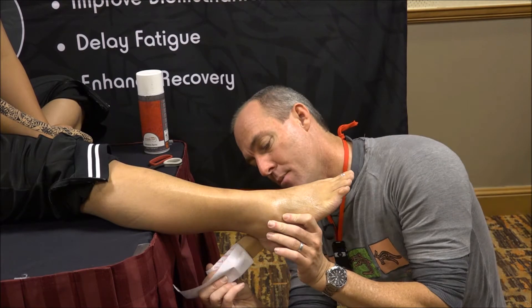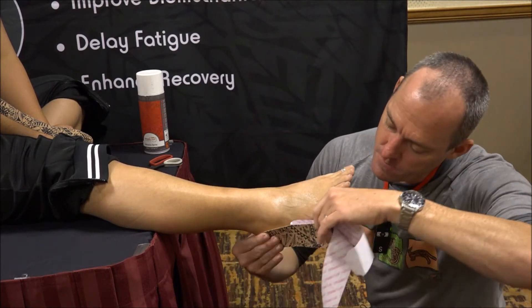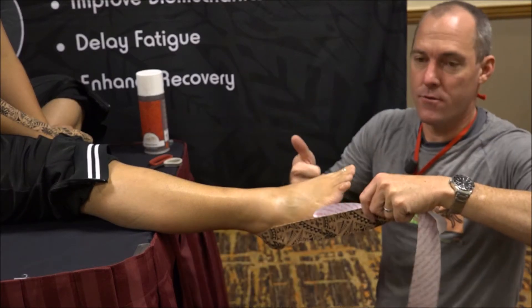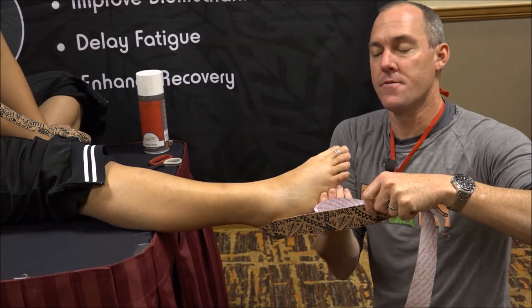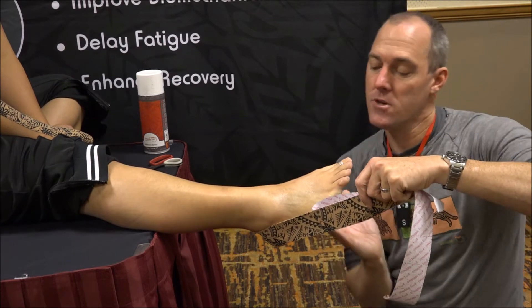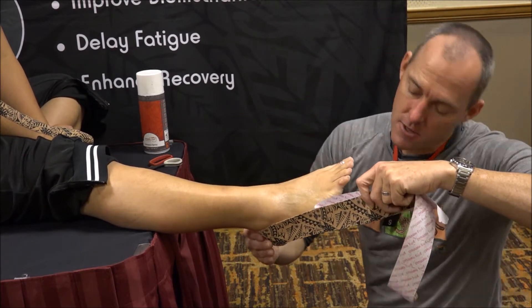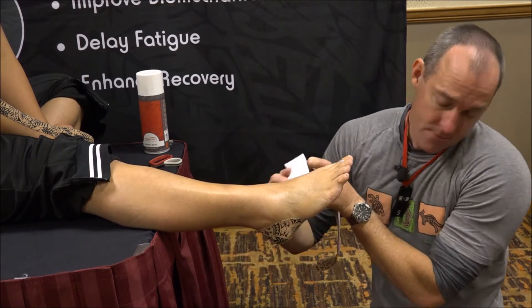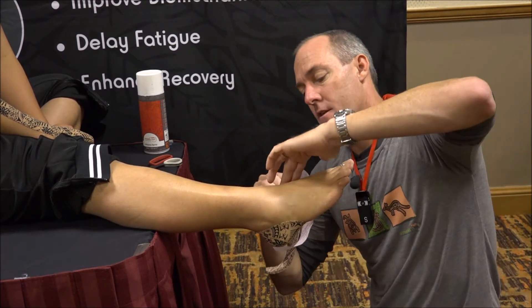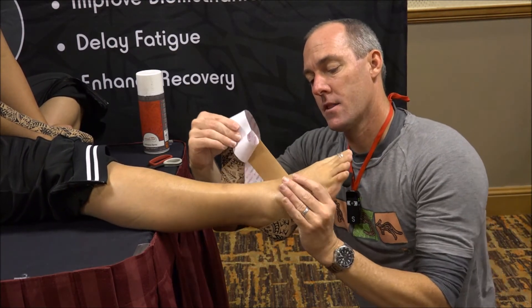Then sweep around the heel — the easy way is to come over the top, but if you think of what our aim is, our aim is to lift the navicular and invert, which means you've got to come up from underneath it. So you actually come around the heel the harder way, underneath. Then find the tuberosity of the navicular and lift it up.